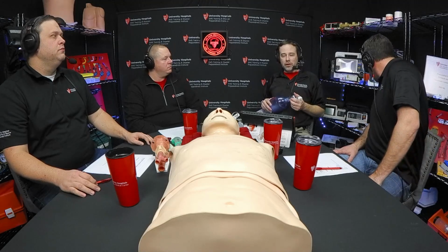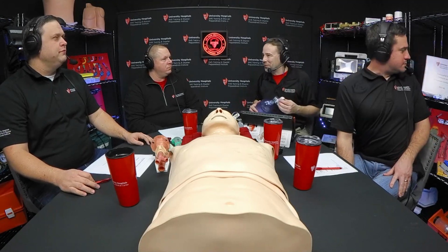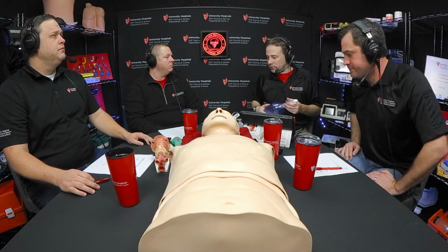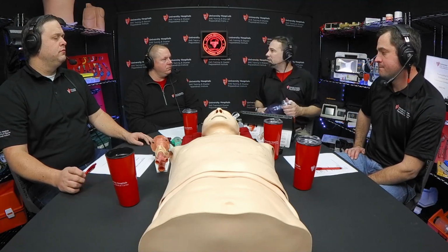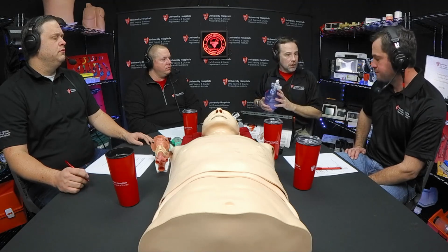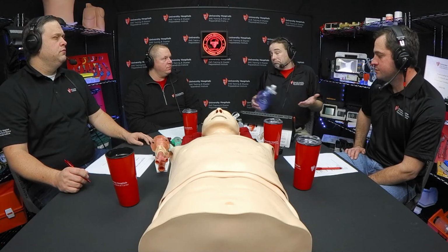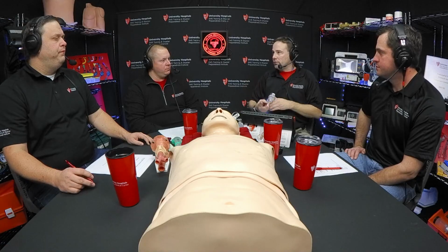Yeah, you're absolutely right. I think we'll see people come in either bagging the patient or with an advanced airway, but nothing in between, right? The other thing I continually bring up, as that's my thing, is that I think a PEEP valve should be standard practice with a BVM. Now, do you need it all the time? No, you don't. But in the cases that you do, I think there are two. One is you're ventilating the patient and they're still not oxygenating well, then you add the PEEP.